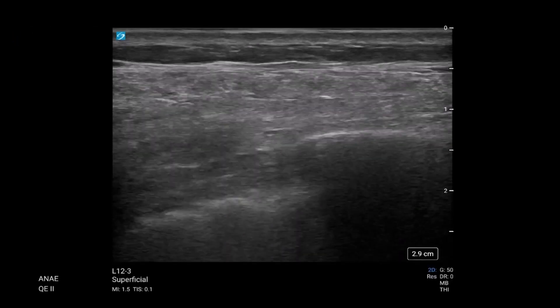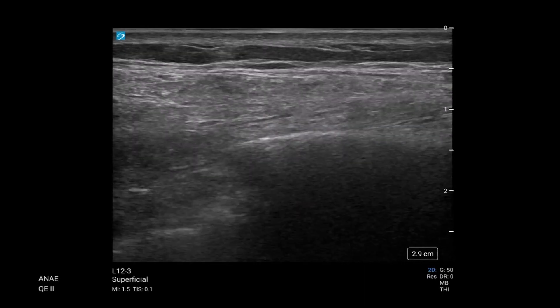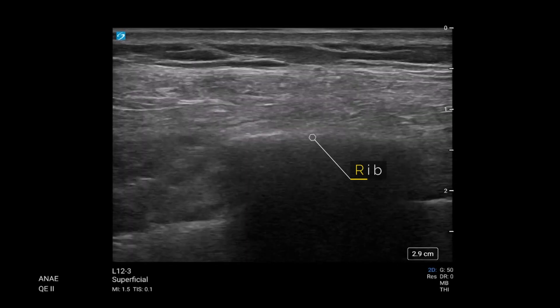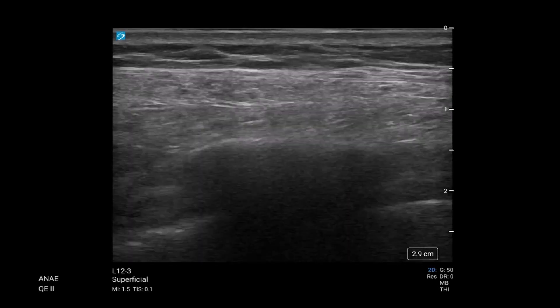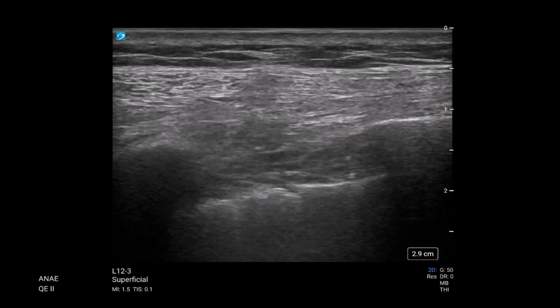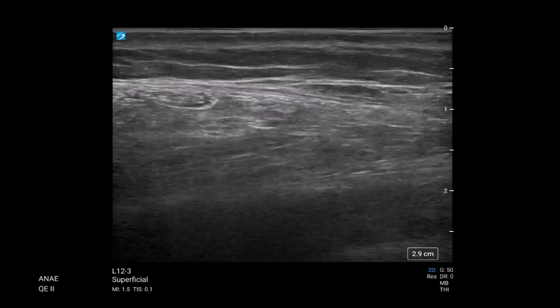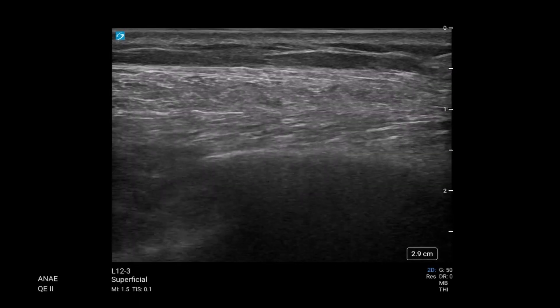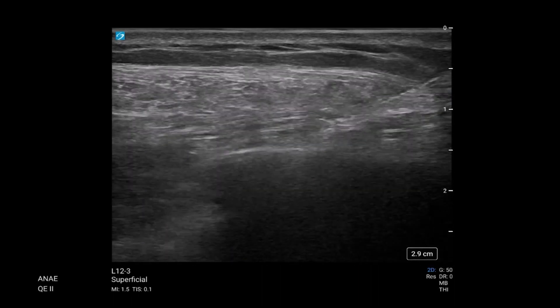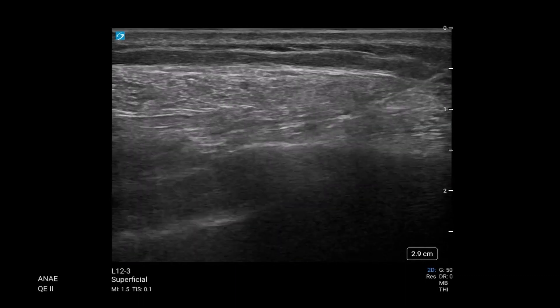This is our next block. It's hard to see differentiation between the two muscle layers — latissimus dorsi superficially, serratus anterior under that. We've got a nice view of rib and pleura, but differentiation between those two muscles is difficult. The muscle fibres are running in different directions, which you can appreciate, but it's not obvious. This is a pretty thin patient. One trick here is to use the lignocaine needle as a seeker for the interfascial space — we've come down using the rib trajectory as a backstop, not hitting the rib but as an extra measure of safety.